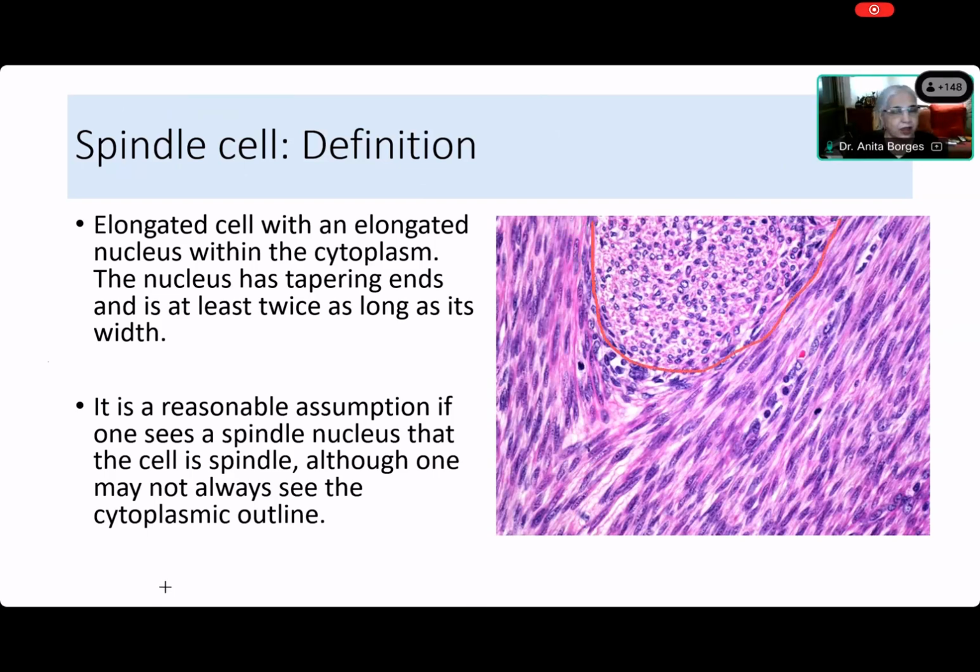All right. So now you're saying that the nuclei over there are not spindle. Do I get you right, Shashank? Yes, ma'am. And they are oval or they are round. Isn't that right? Yes, ma'am. Excellent. So what was polygonal over here? Ma'am, some nuclei are different. Not typically polygonal, ma'am. They are almost oval. So then use the word that you want to use. Ma'am, round to oval.